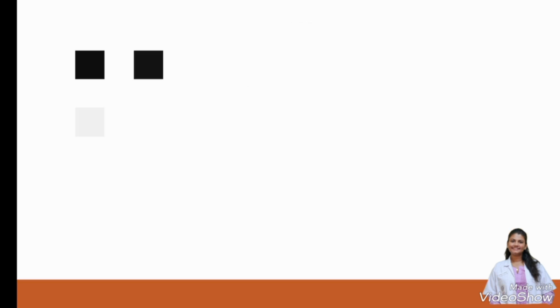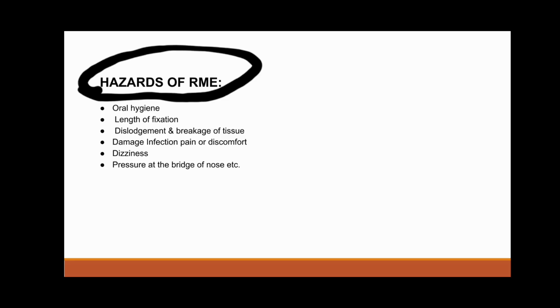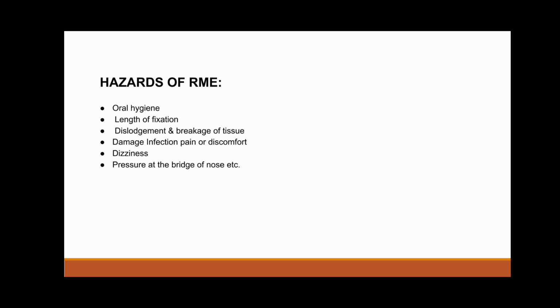Now we will discuss hazards of RME. Hazards of RME: poor oral hygiene, length of fixation, dislodgement and breakage, tissue damage, infection, pain or discomfort, dizziness, pressure at the bridge of the nose, etc.